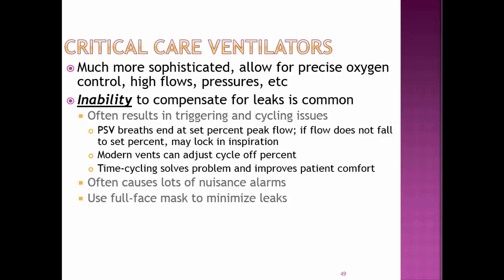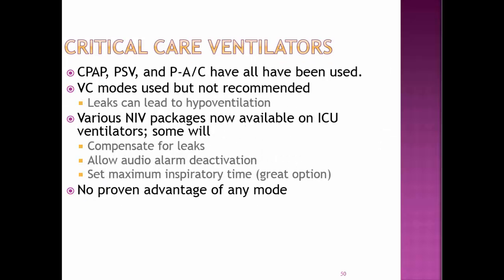They often cause lots of nuisance alarms, and use of a full face mask to minimize leaks is sometimes a better option. Now, one thing about these total masks, not necessarily the full face mask, but the total one that covers the entire face, they are not disposable. So don't throw those away. Those are to be cleaned and reused. They're very expensive. CPAP, pressure support, and pressure assist control have all been used in the critical care ventilators.